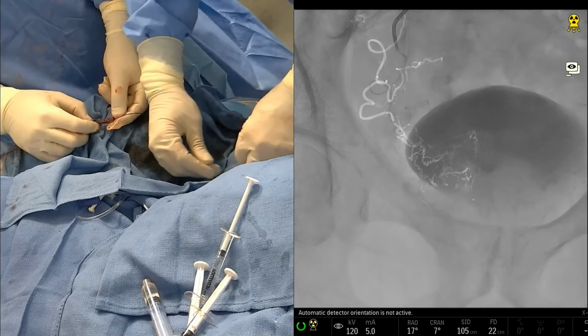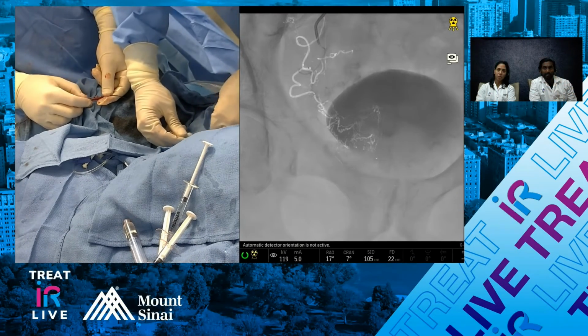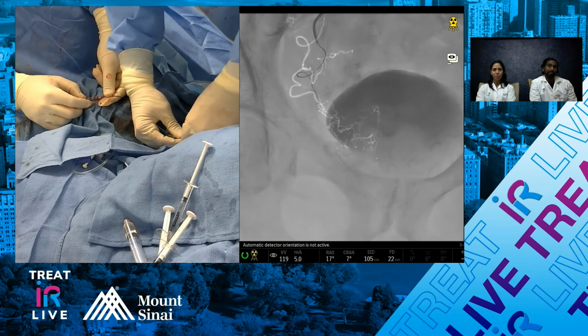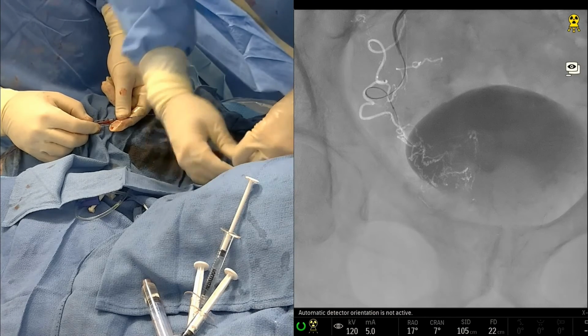Do you want to pull back the catheter a little bit? Yeah, a little bit. I don't know, I think it might be a little over for me. Aaron, once you get the wire in, you may be able to advance your base catheter sort of into the... Maybe. You can give it a shot. Yeah, we'll give it a shot. Maybe. We don't want to get greedy. We've got to make a turn here. That's the challenge on this one.